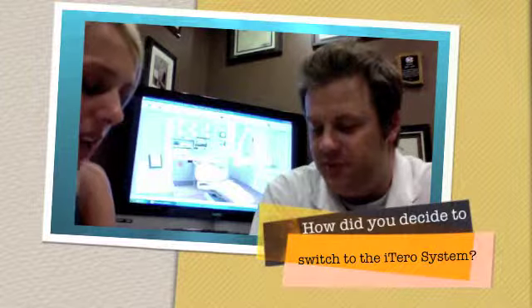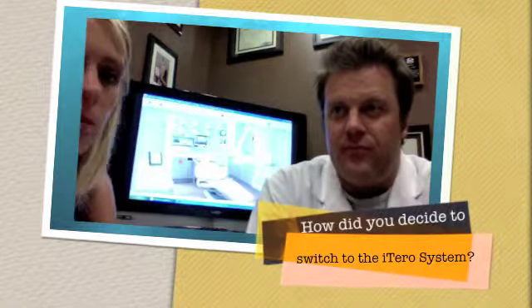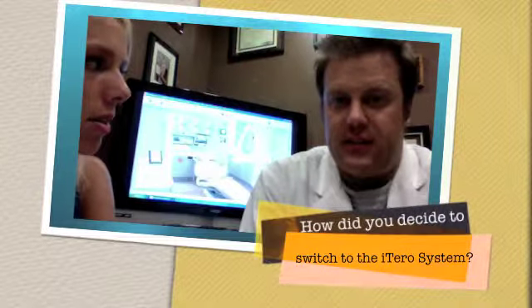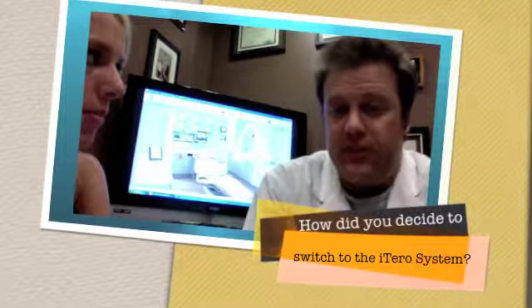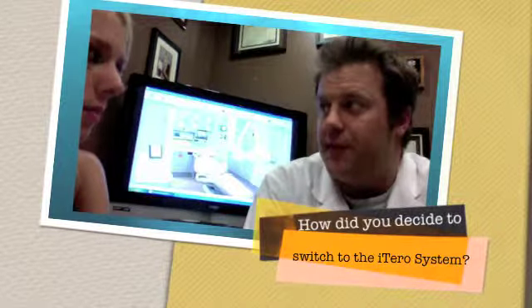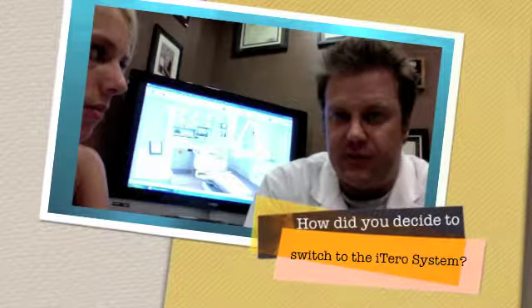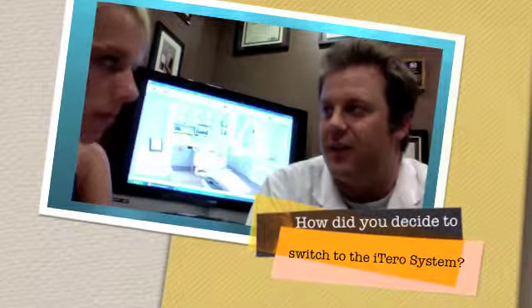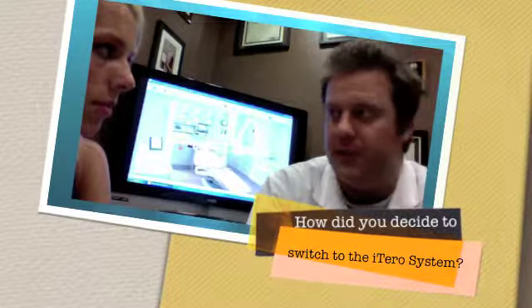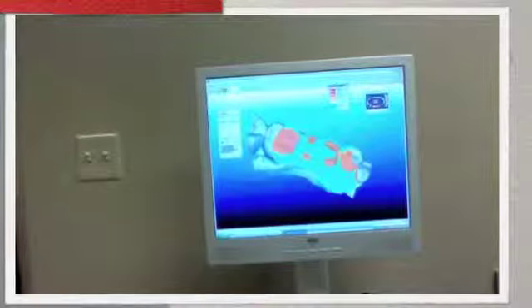What made you decide as a practice to implement the iTero system? Preciseness. It makes everything that I do more precise, which is good for the patient, good for me. I don't have many remakes because if the model is perfect, exactly like it is in the mouth, then the lab doesn't have to end up making remakes and I don't have to make another appointment for the patient to try it in again. Everything just fits.